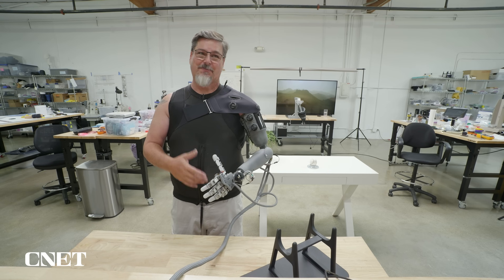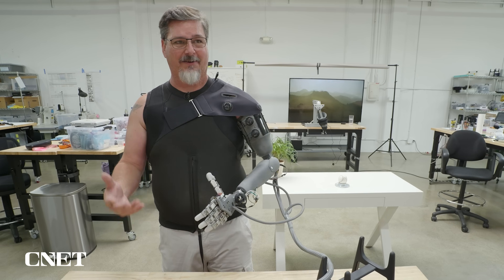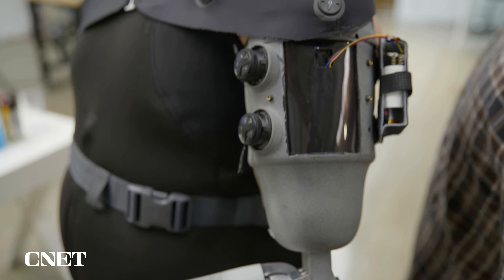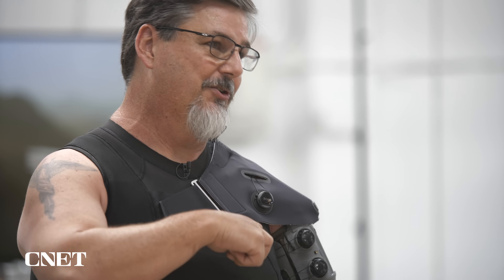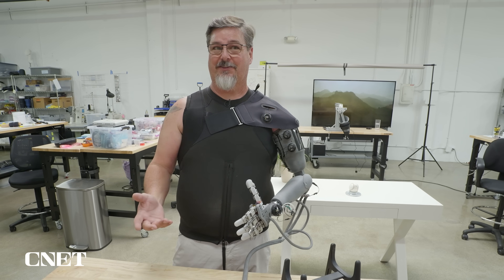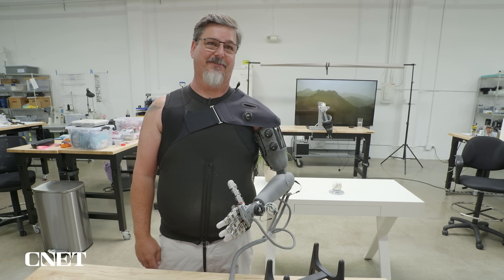It is four pounds, but it feels like maybe a pound and a half, two pounds that I'm actually having to lift. It's a lot different from anything in the past. Pulling my arm into an airtight socket using what's called a pull sock is pretty strenuous, and sometimes you don't get it right the first time. But this — once I get it on, it's nice and secure every time, and it's fast.